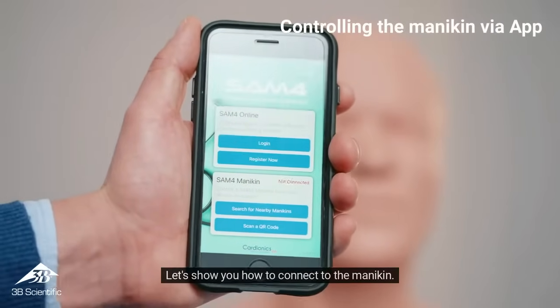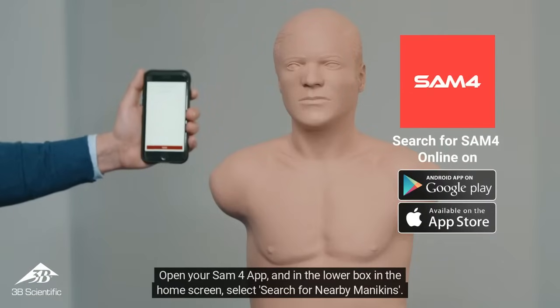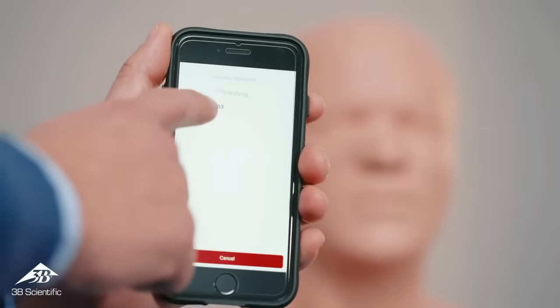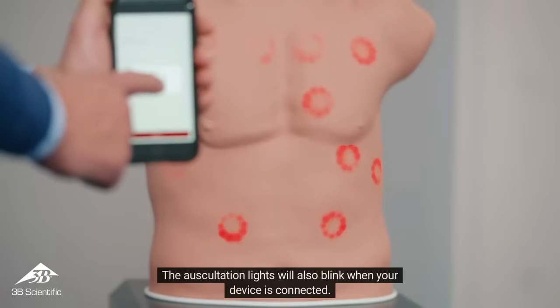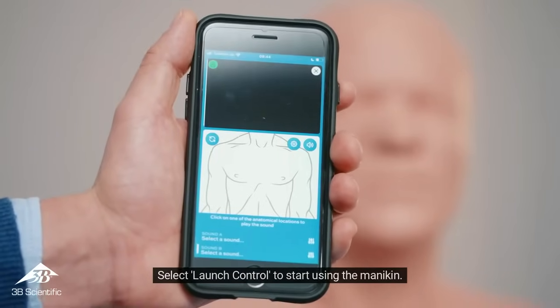Let's show you how to connect to the mannequin. Open your SAM-4 app, and in the lower box on the home screen, select 'Search for nearby mannequins.' After the search, a list of available mannequins will be displayed. Select the mannequin in the list, and a confirmation pop-up will appear on the screen. The auscultation lights will also blink when your device is connected. Select 'Launch Control' to start using the mannequin.